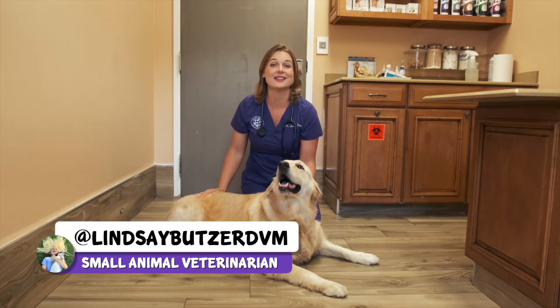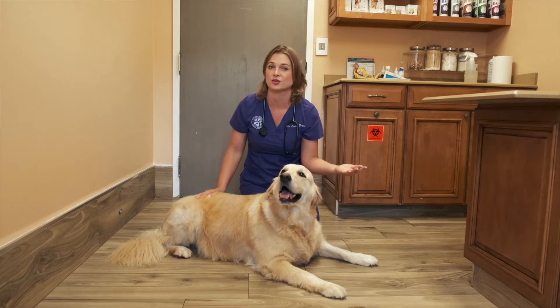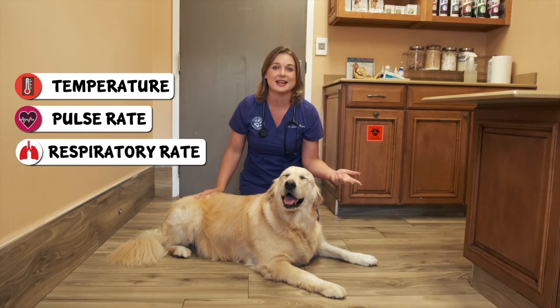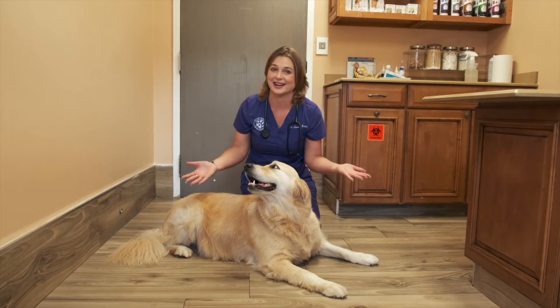Hi, I'm Dr. Lindsay, and in this video I'm going to teach you how to take three vital signs from your dog — the TPR: their temperature, pulse rate, and respiratory rate. This will give you a good idea if your dog is healthy or if your dog could be dying.